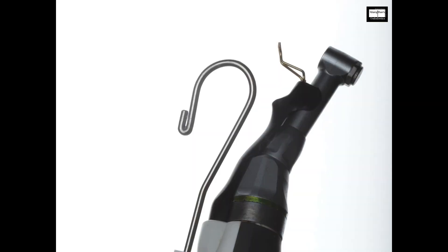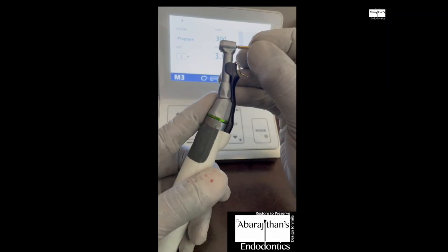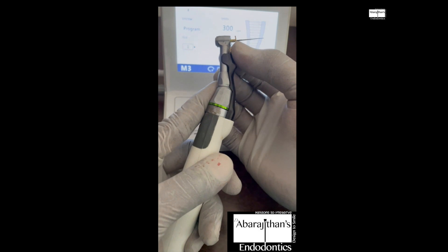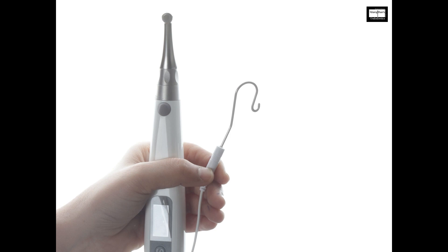There are also some endomotors that have an integrated function, and most of these endomotors have a separate accessory — an attachment that is fixed to the head and comes in contact with the rotary file to complete the circuit. The lip clip touches the patient's oral mucosa, and the file in contact with this extra accessory attached to your handpiece completes the circuit.